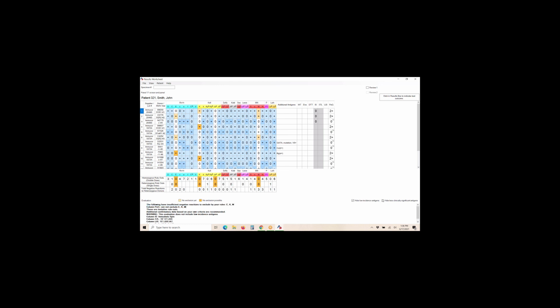There's also one for hide less clinically significant, and that would be things like your Lewis's, your XGAs. But in this case, it does remove M as well, because they're not always clinically significant either. But we're going to want to exclude M just for the demo, just so we can make everything look beautiful up here for you. So we're going to use a double dose cell for that.